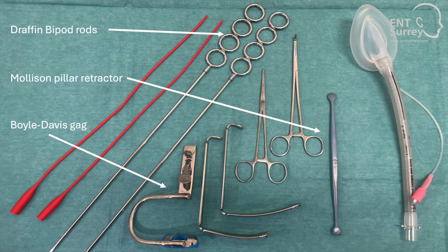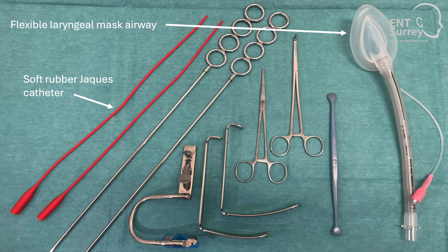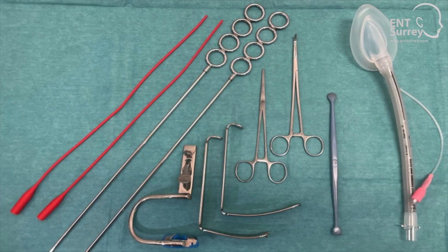I use a standard setup with a Boyle-Davis gag, Draffin rods and a Mollison pillar retractor. I often use soft rubber catheters to hitch up the palate to access or double-check the superior aspect of the tonsillar fossae. I operate with a flexible laryngeal mask airway in almost all cases rather than an endotracheal tube, which helps with operating theatre efficiency and usually does not negatively impact on the surgical view.